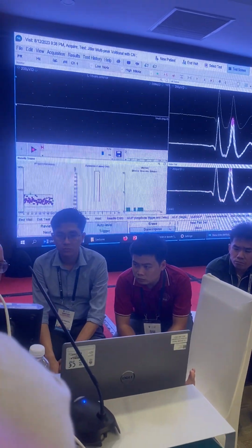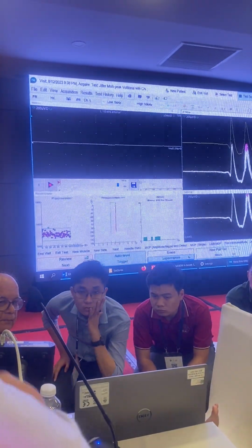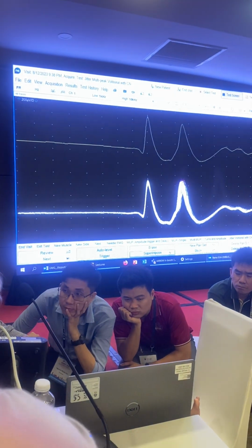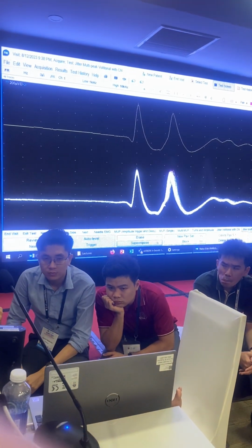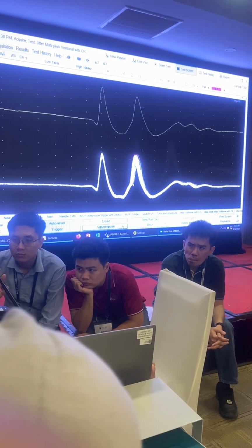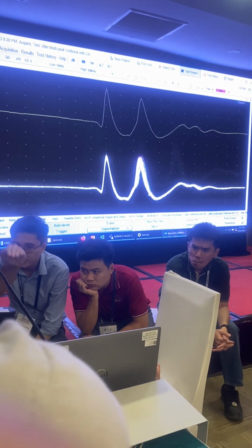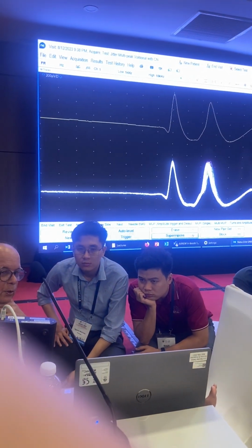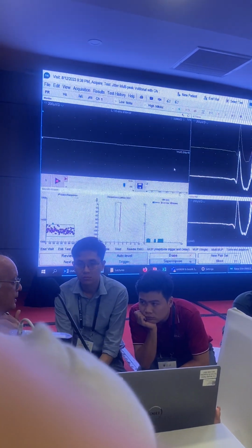Strictly speaking, it has a shoulder over here too, if you look carefully. See, it has a little bit of shoulder, but it's way far below. It's not close to the peak. So in that case, I will accept it over here. So in the paper by Professor Stalberg and Sanders, it tells you when the shoulder is acceptable. If it is way below, away from the peak, then that's fine. Okay? But if it is closer, then that is not good. Any questions on jitter analysis?